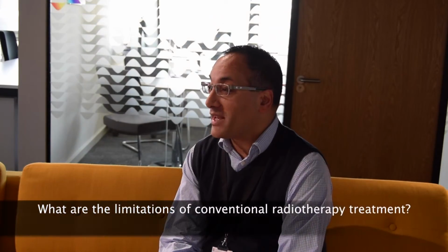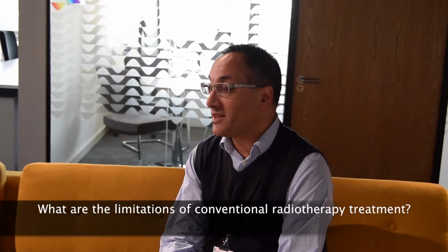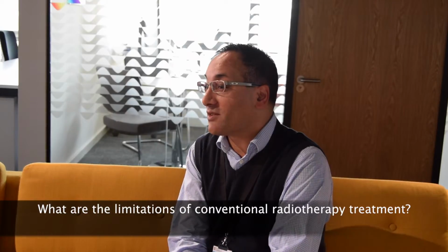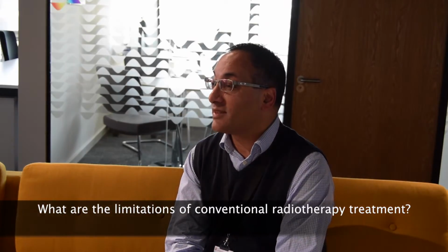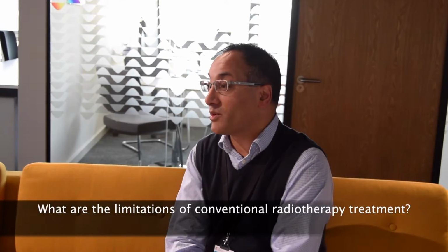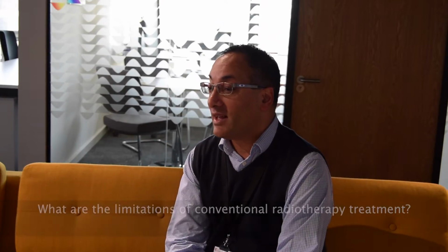The workflow for radiation therapy can be very intensive. It involves looking through lots and lots of slices, lots of images of a patient's anatomy and carefully outlining what is tumour and what are the critical structures that we want to avoid with radiation therapy. And depending on the nature of the tumour, that can take several hours of time. Not only that, but it's actually a difficult process to learn and get experience from for our doctors who are actually training in radiation therapy.